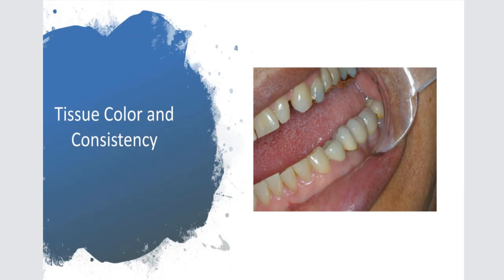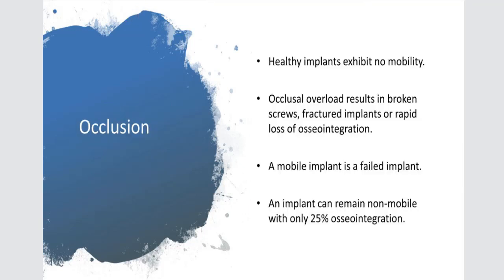You can actually take 2 fingers on either side of an implant and squeeze tissue and see if exudate's going to come out. That's another really good way to tell. Sometimes when the patient bites down, if the occlusion is high, you're going to see something come out of the pocket. One of the hygienists that actually was using air clean mentioned to me that she was able to see the debris and the bacteria come out as she used the air clean in the area.